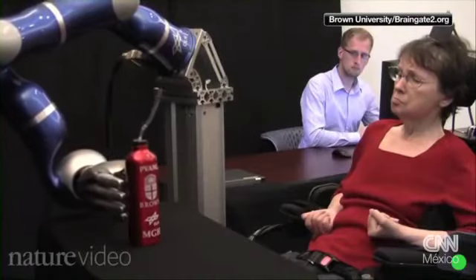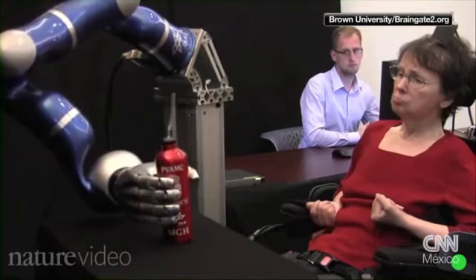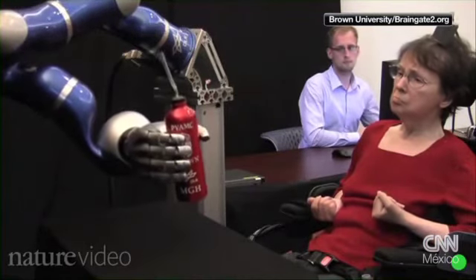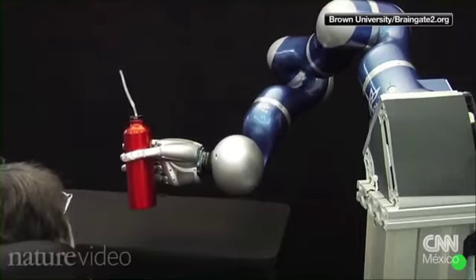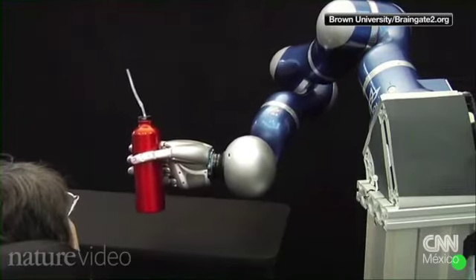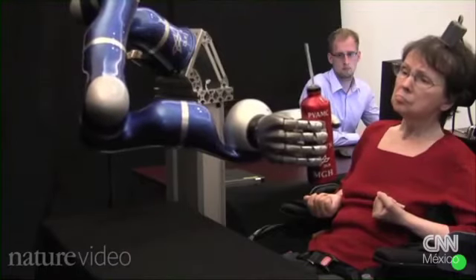You're watching the most advanced brain-machine interface in action. Kathy Hutchinson is paralysed and unable to speak, but just by thinking she's able to control the movements of this robotic arm and drink her morning coffee. She's part of a pioneering study run by researchers at Brown University in the US.